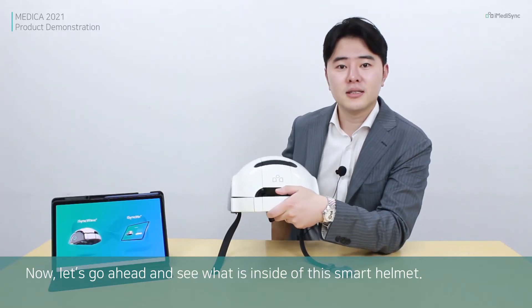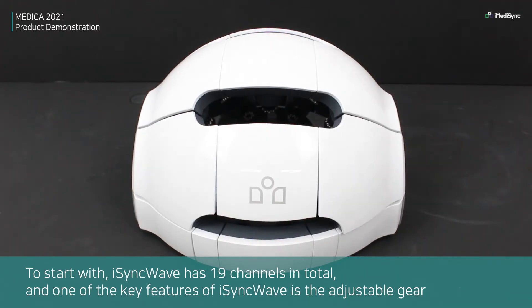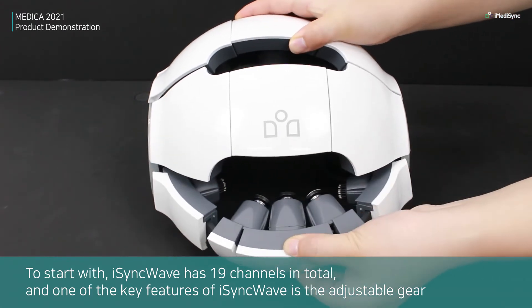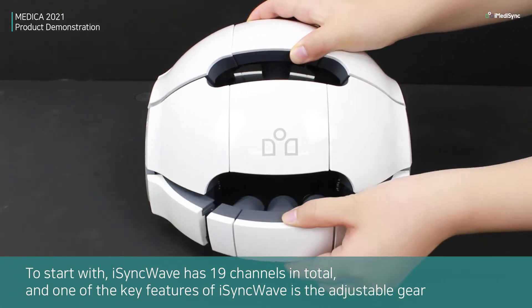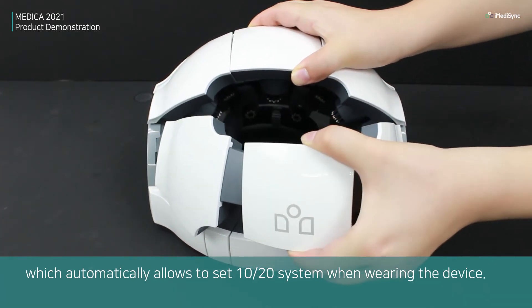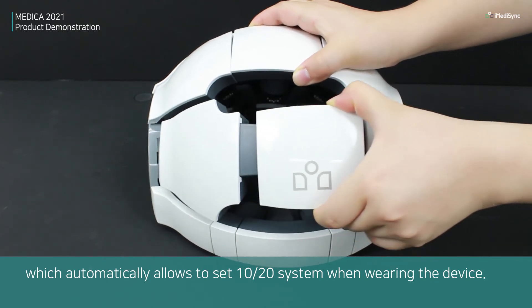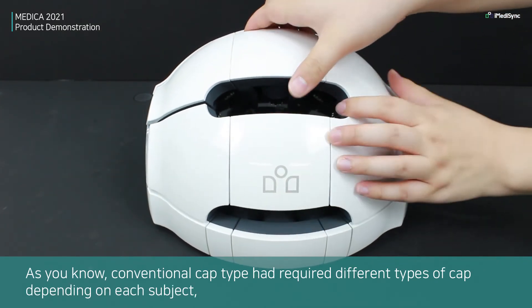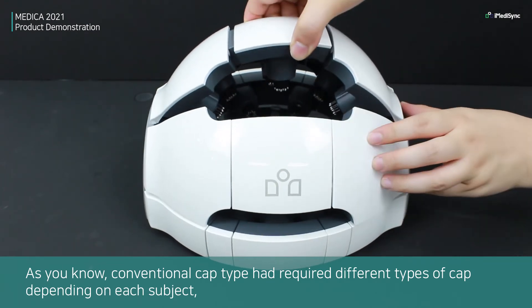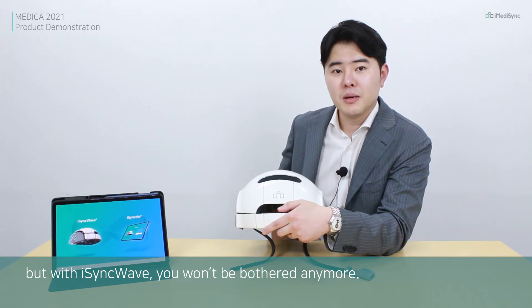Now let's see what is inside this smart helmet. iSyncWave has 19 channels in total, and one of the key features is the adjustable gear, which automatically sets the 10-20 system when wearing the device. Conventional EEG caps require 5 different cap sizes depending on each subject, but with iSyncWave, you won't be bothered anymore.